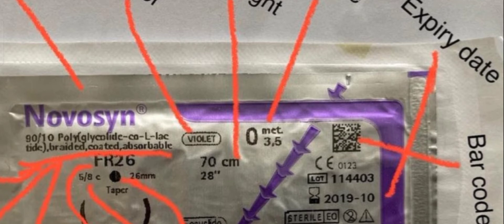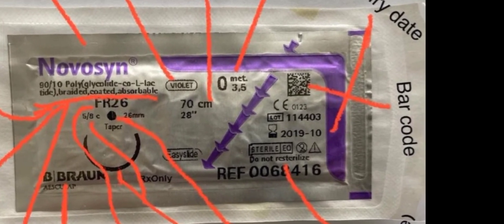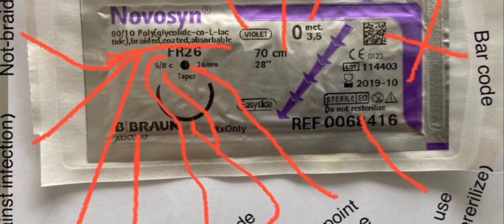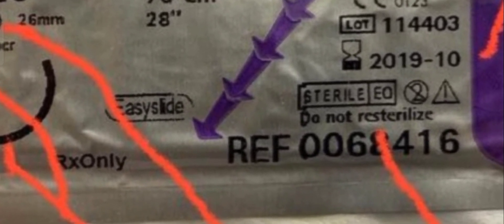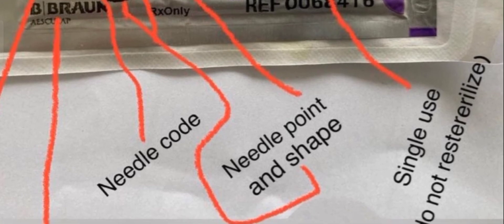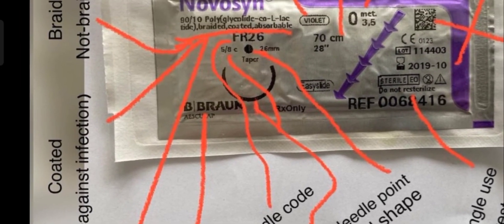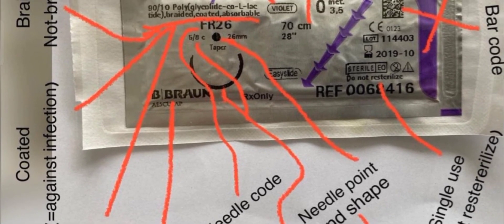You must know about the expiry date of the suture — that's 2019, month 10, that's the expiry date. Then there is a barcode you can scan with the help of an application on your mobile. Here you must focus: 'Do not resterilize' — it means you will not use it again, it is single use only.